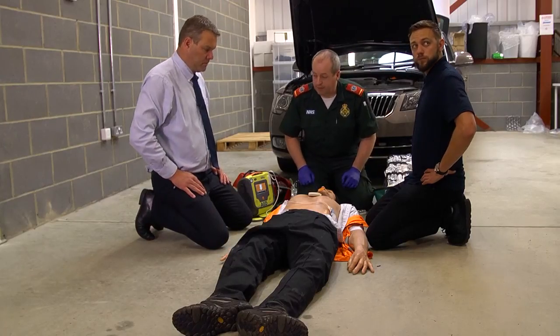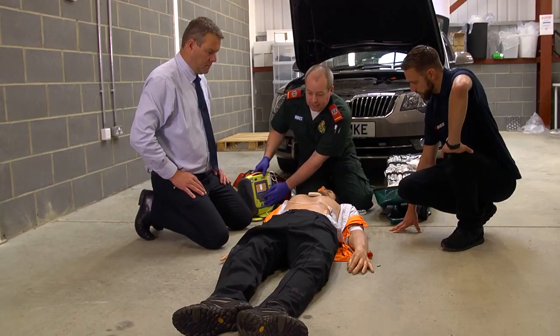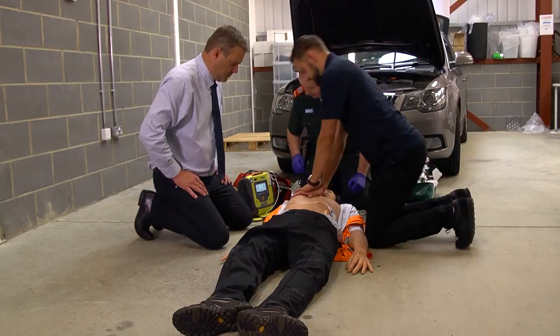Okay, just stand back, everybody clear. Nathan, just watch your knee there. Don't touch the patient. Stand clear. Press the flashing shock button. Okay, straight back on the chest. Shock delivered. Nathan, thank you.